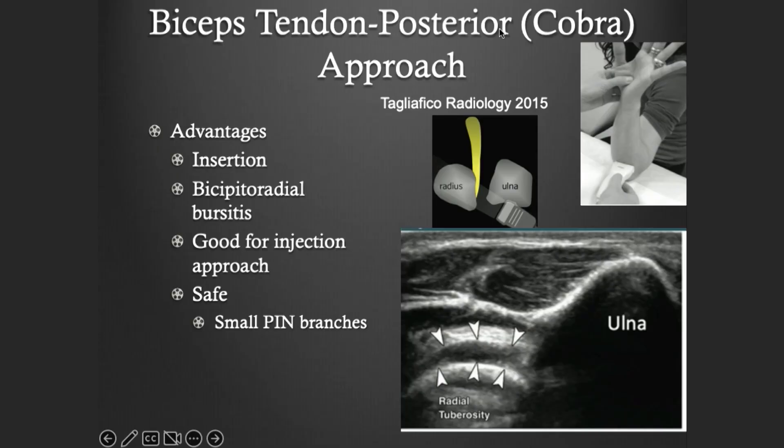The last approach is something called the cobra approach, because the position of your hand is going to be shaped like a cobra. You're going to rest the elbow in flexion, and you're going to place your probe over the posterior portion of the proximal forearm. You're going to look at the ulna and the radius, and what you're going to see is this little, almost like a bird beak — this is the distal insertion of the biceps tendon onto the radial tuberosity. The downside is you don't see the proximal portion of the biceps, you just see the insertion.